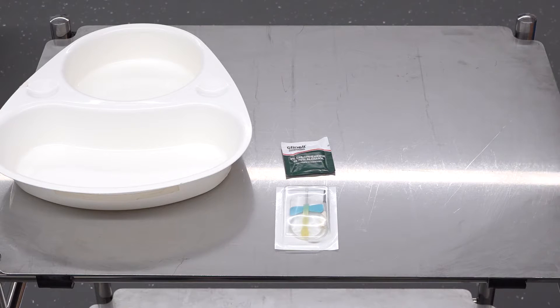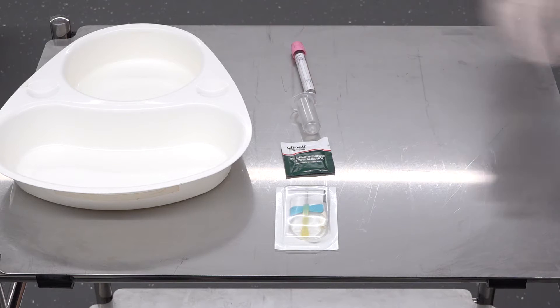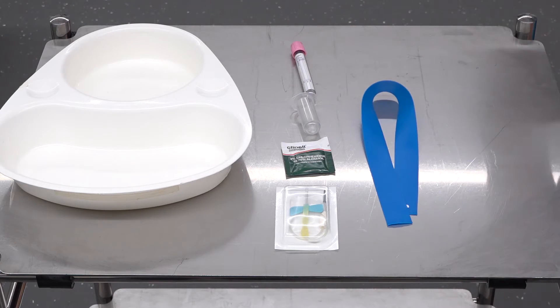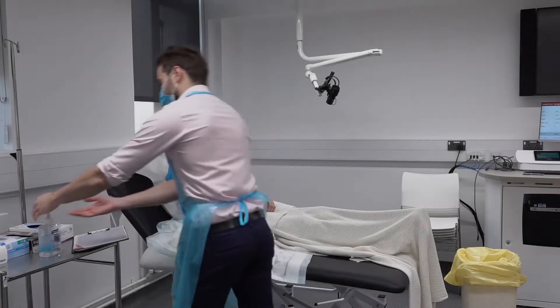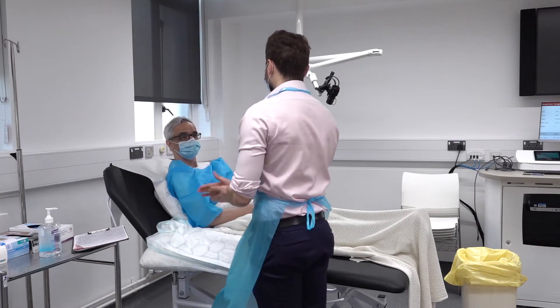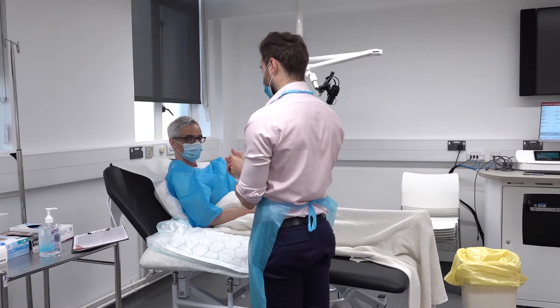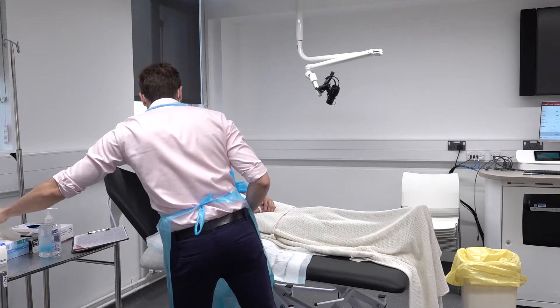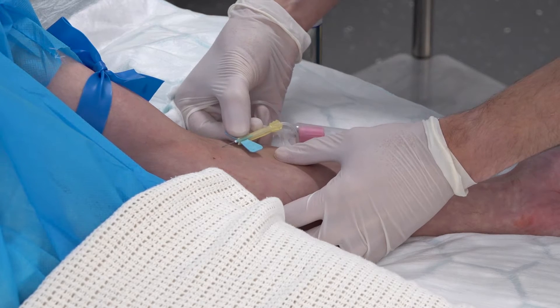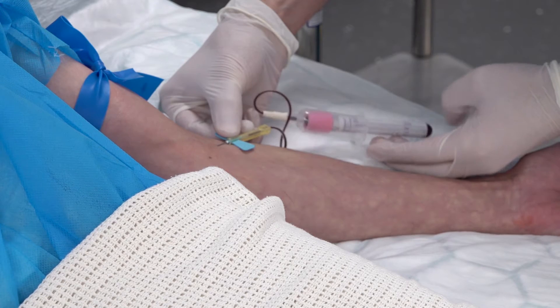You will need the usual equipment used for venipuncture. Most trusts use a pink top bottle for the pre-transfusion sample. Do not write the patient's details on the bottle before taking the sample. Check all equipment is in date. You are now ready to perform the procedure. Wash your hands and put on a plastic apron and gloves depending on local PPE requirements. Before performing the procedure, check the patient is happy to proceed. Take blood in the usual manner. You can review our video on venipuncture if you require further guidance.